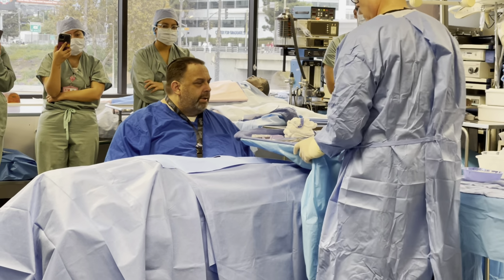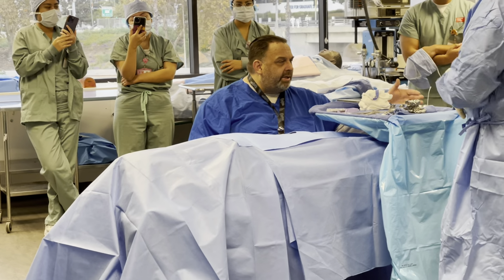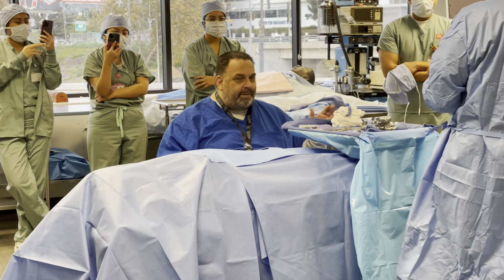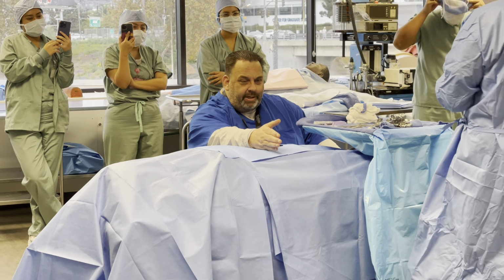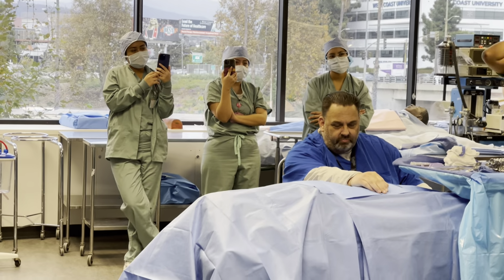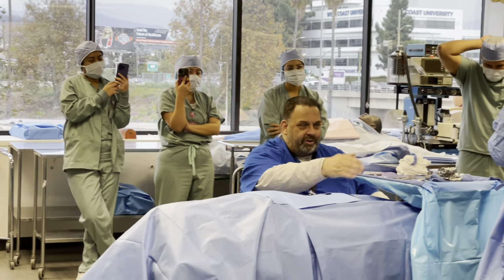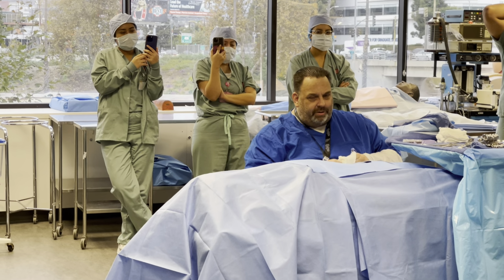All right. His table is right next to the side of him, and he's standing behind his Mayo stand, right? If he's standing over here, who would be standing here? Resident, PA, assistant, anything. But you guys are always behind your stand. You also need to have 2 laps up on the field.